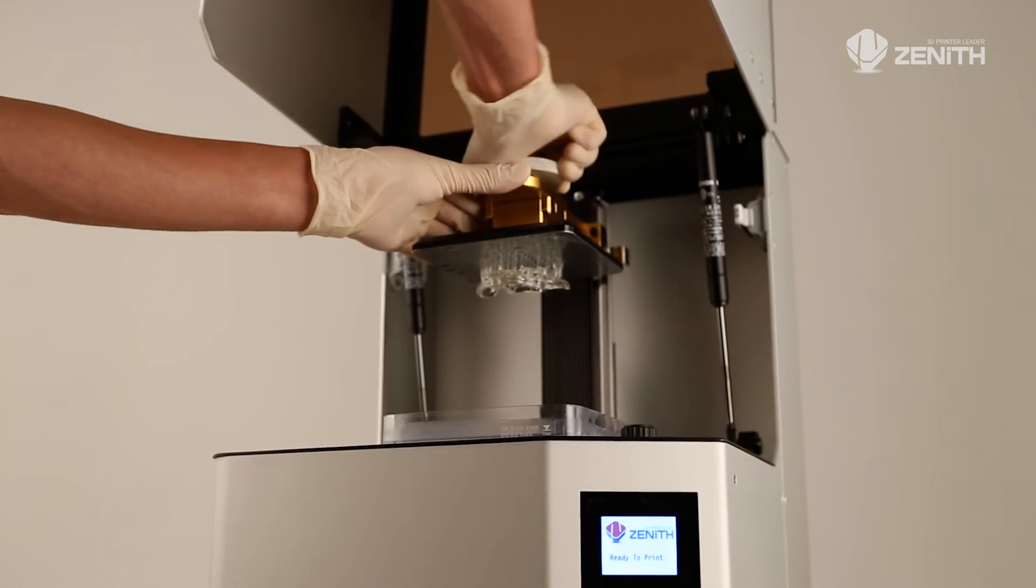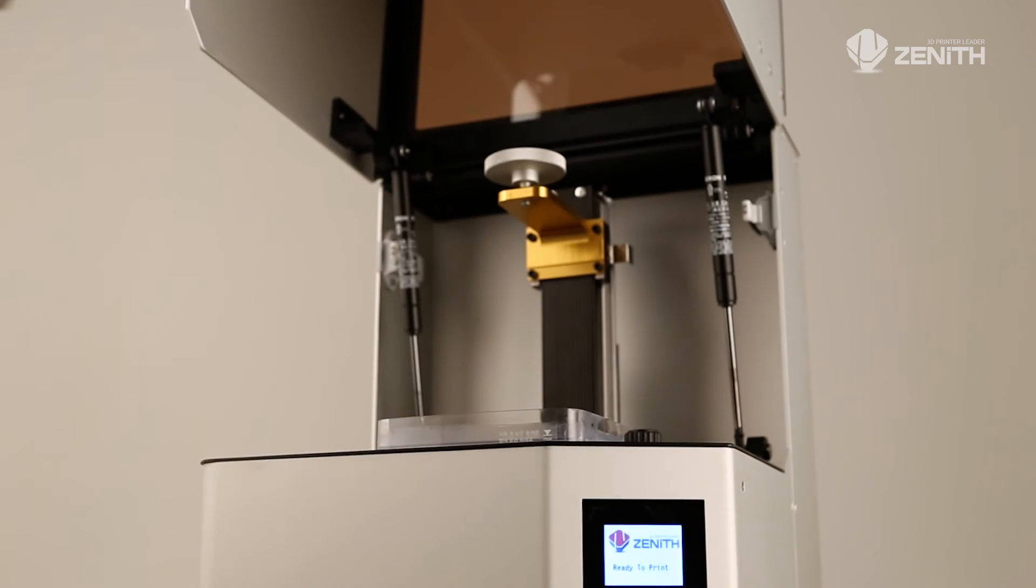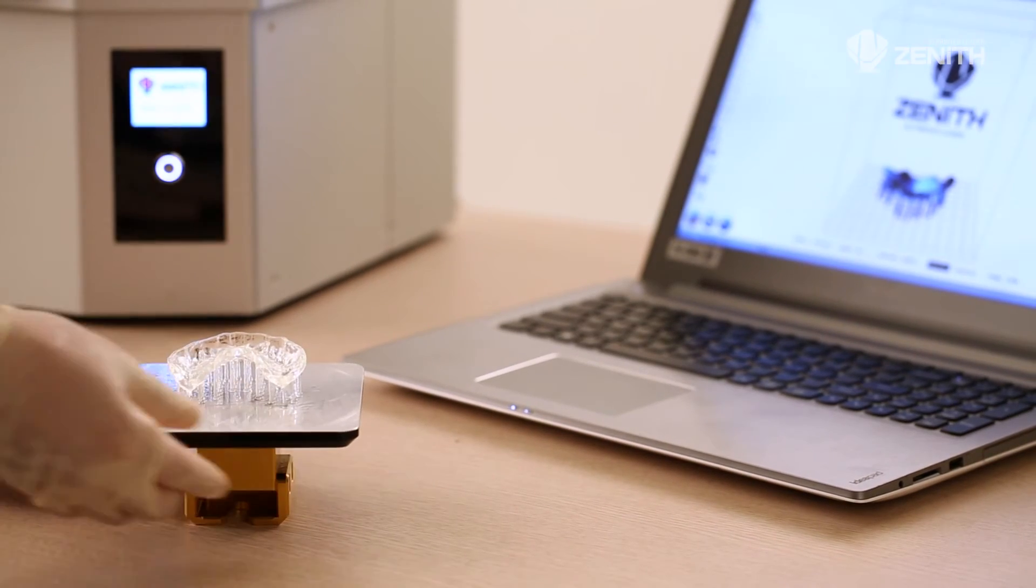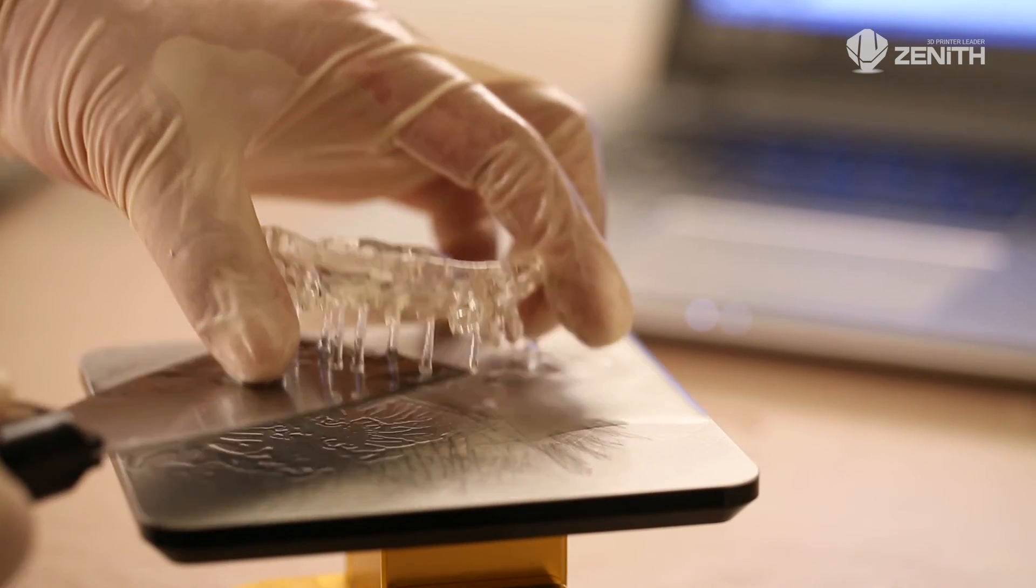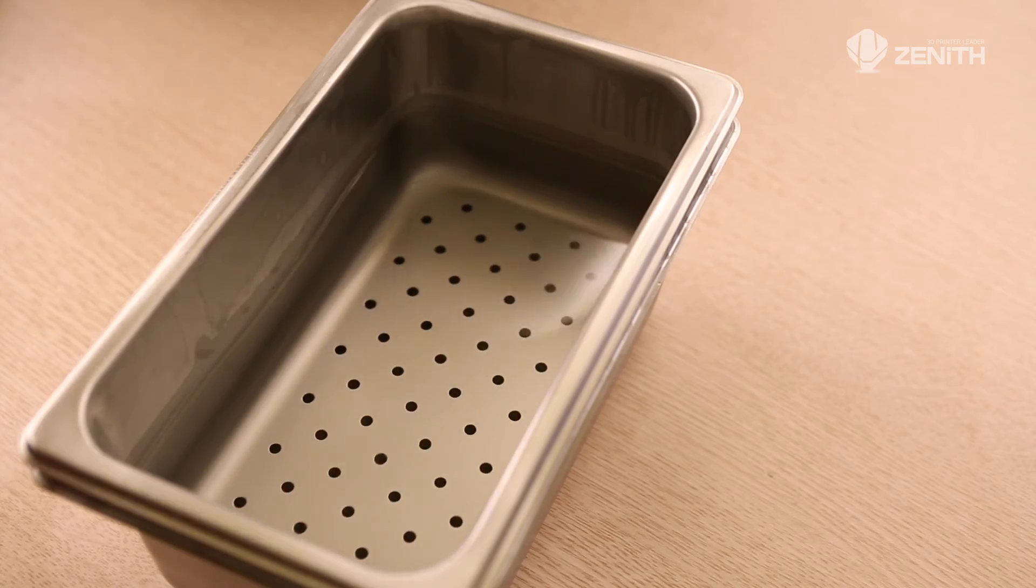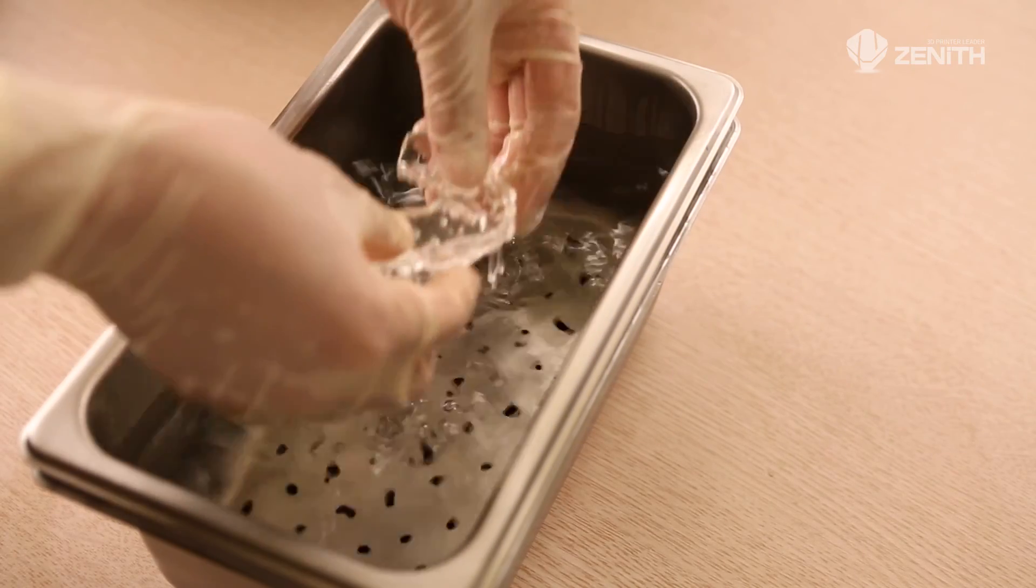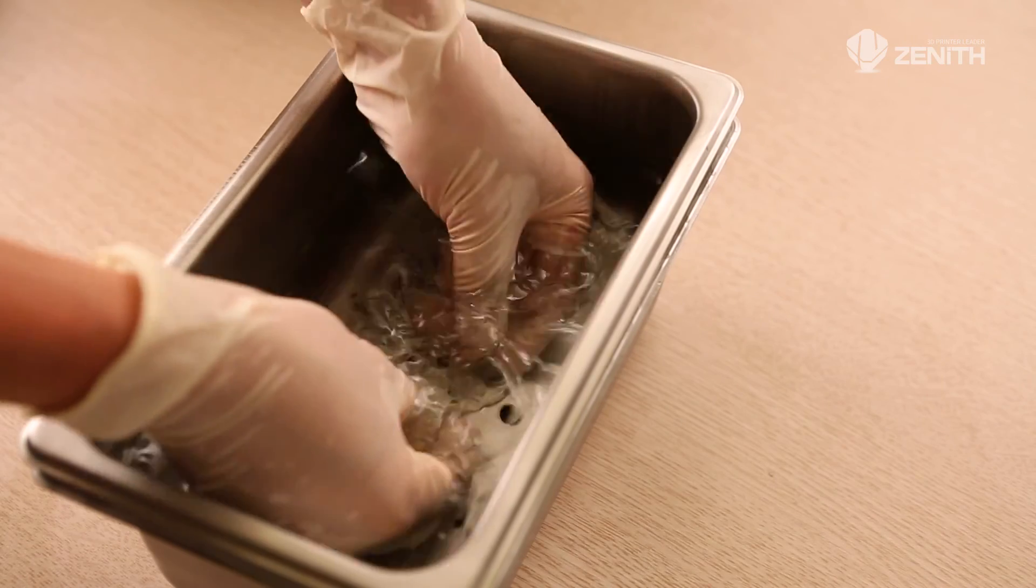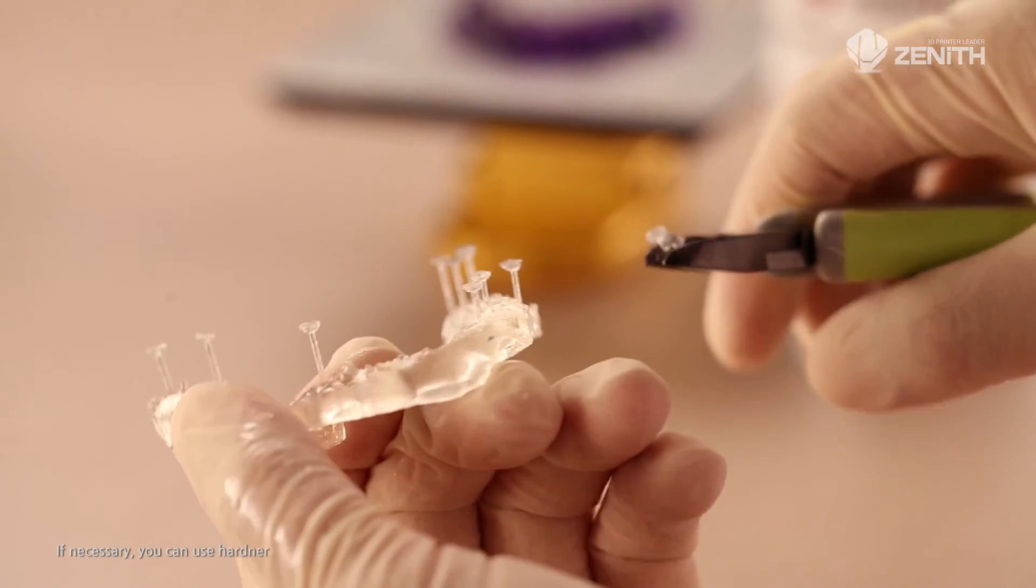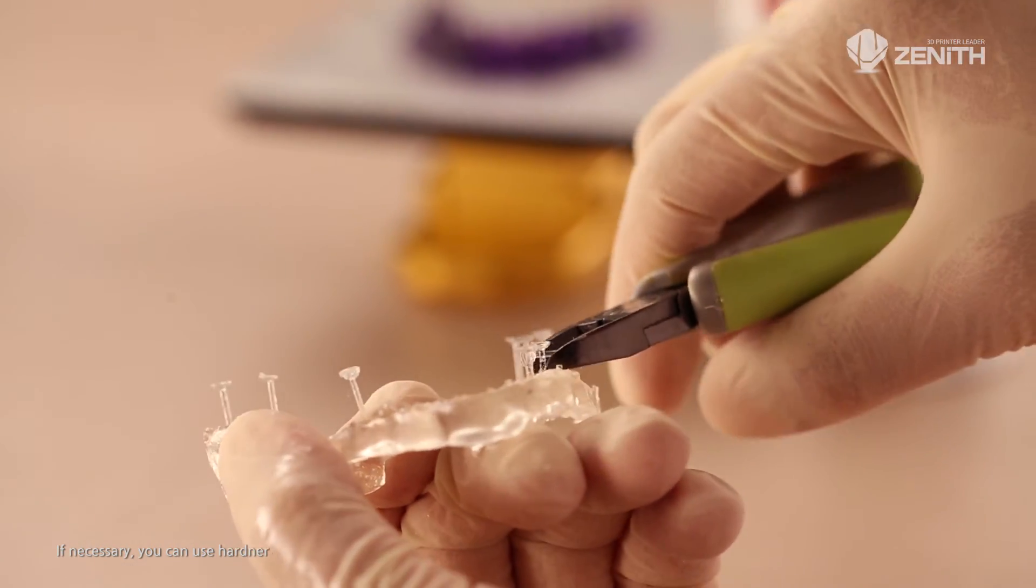After printing, detach the working plate. Detach the model slowly not to damage the surface of the working plate. Wear gloves and soak the model into alcohol and wash it for 10 minutes.